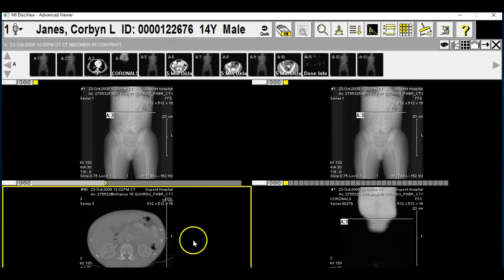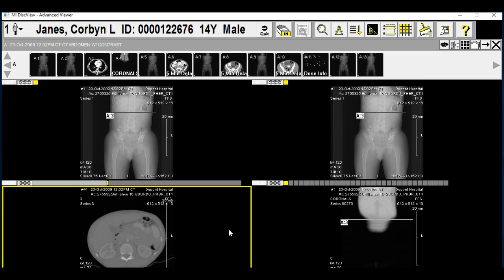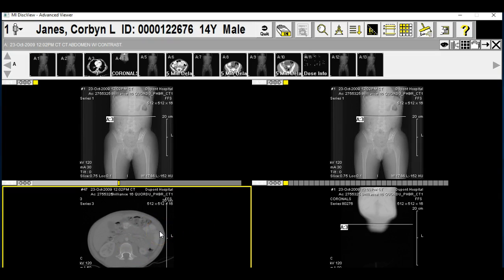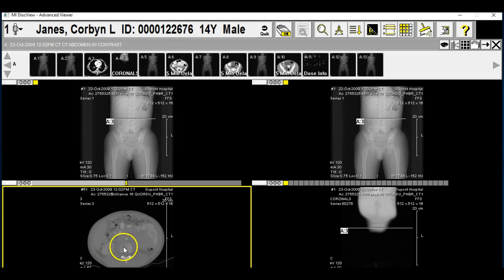If you look very closely, you can actually see a ureter on this kidney in this slice. The ureter goes down to the bladder, and here's the bladder coming up here.